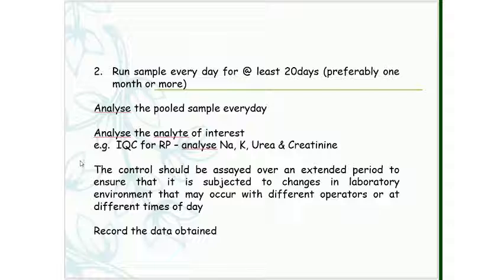Then the control should be assayed over an extended period to ensure that it is subjected to changes in the laboratory environment that may occur with different operators or at different times of day. And don't forget to record the data obtained.